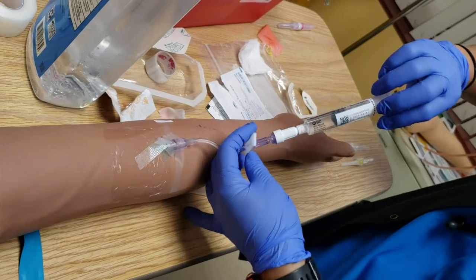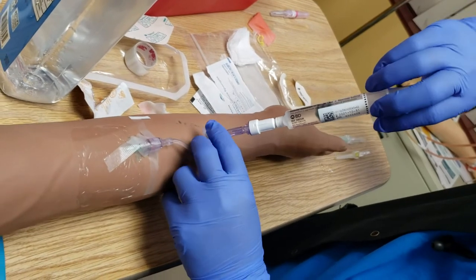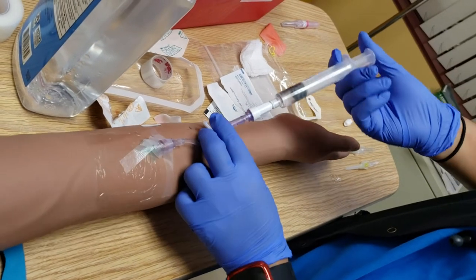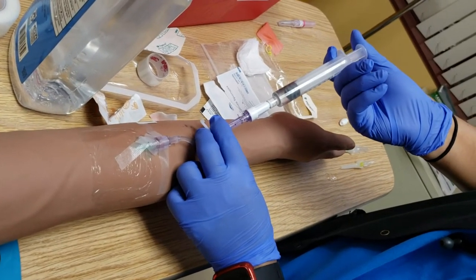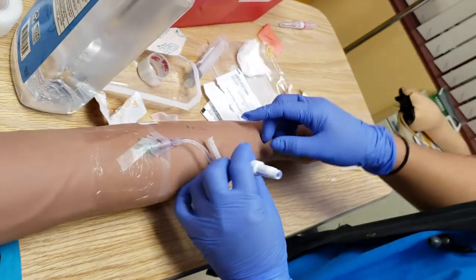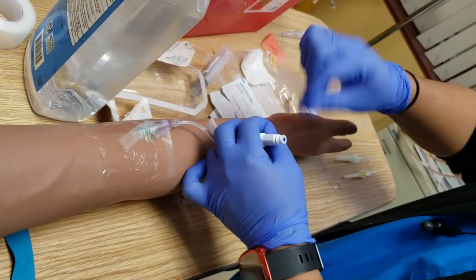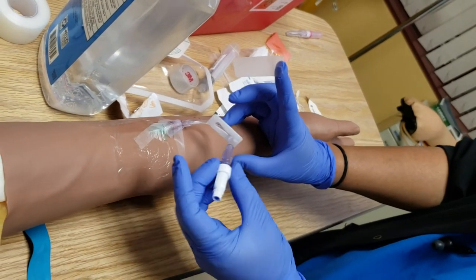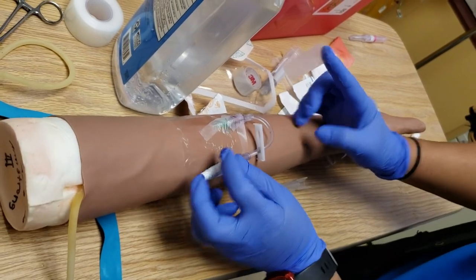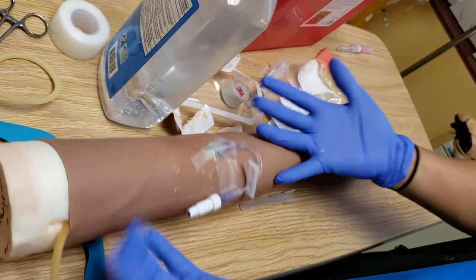Take the rest of this flush and hold on to the clamp. As I'm pushing this forward, I'm going to flush forward — you're going to use about two cc's. You want to flush forward and clamp at the same time; that's going to prevent backup into your catheter hub. Now the rest of it I'm going to tape. You want to make sure this is secure — if you see any IV that's not secure, you need to tape it, because it's easily snagged on things. Wrap it around, and there you are.